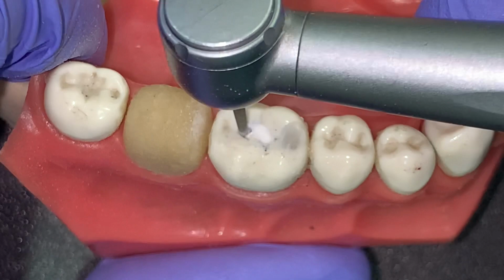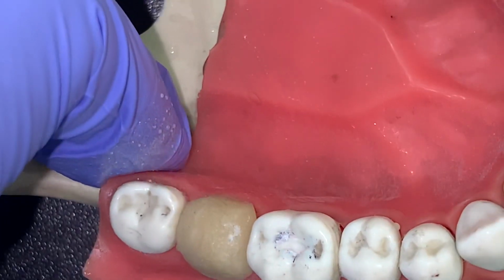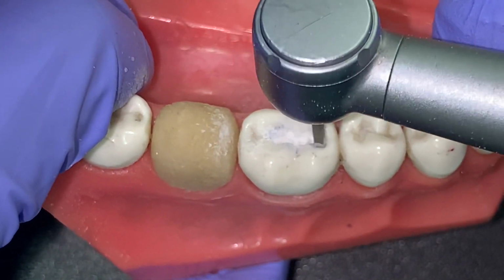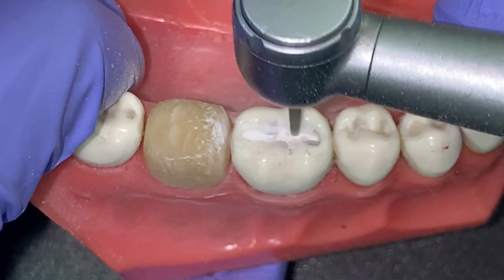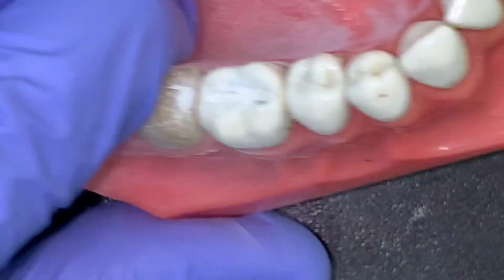The central groove is most commonly the least prepared or the unprepared area of the tooth when we send this tooth preparation to the lab. So what I do in my clinical practice is that I usually start with the groove area only.